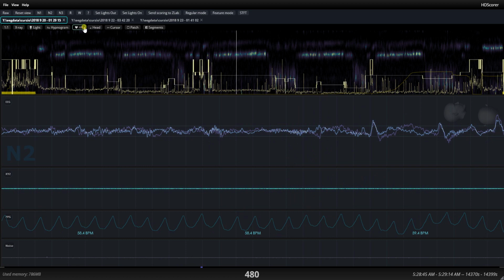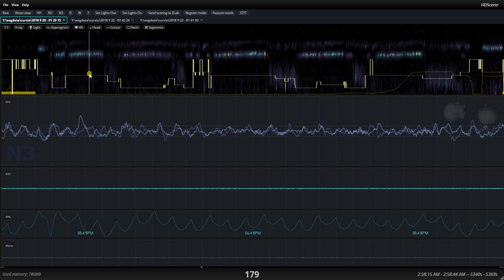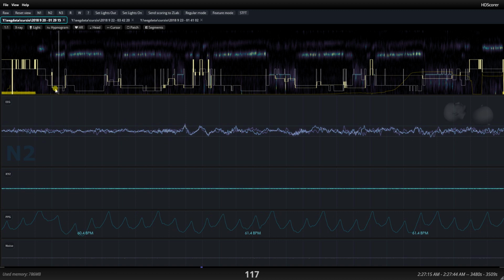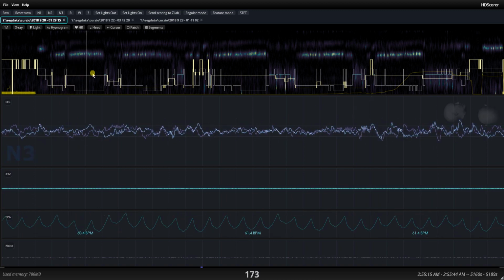If you want to see also something interesting, the hypnogram superimposed with the head position. So what I want to see is whether the head position has anything to do with my sleep quality. And again, sorry, this doesn't really have any labels, but you just scroll to here and you look at the head, and now you know that this level means I'm sleeping with my face to the right. Okay, so back to hypnogram. Does sleeping with my face on the right side help? Maybe, because look, here I was sleeping with my face pointing to the left, and I stayed in N2 sleep for quite some time. Then I turned right, and pretty soon I was in N3 sleep.